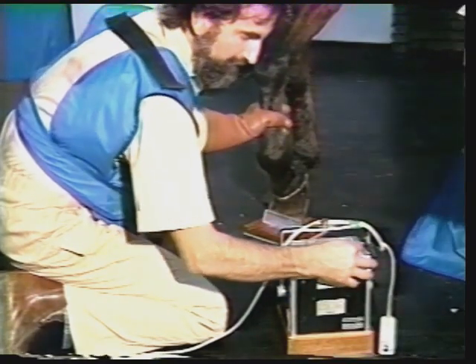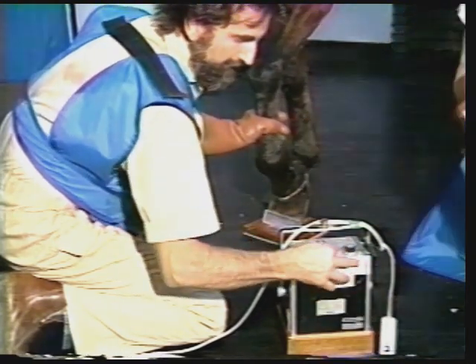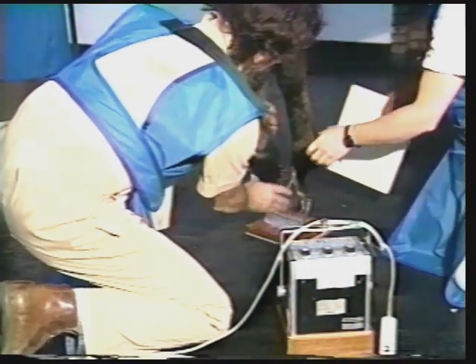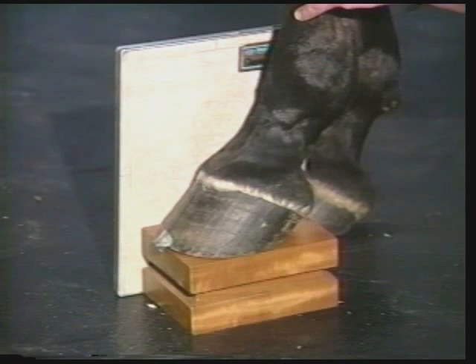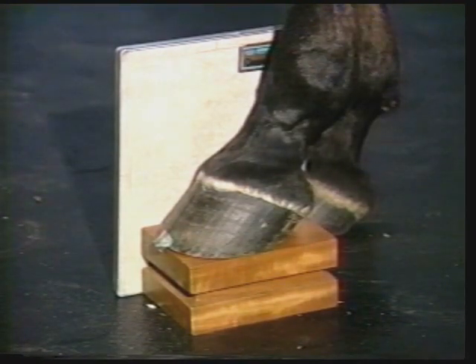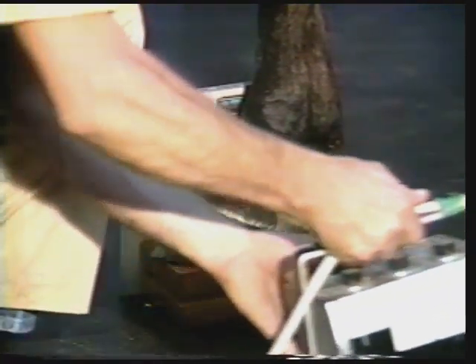It also allows me to set the foot in a position that allows me to take all my views, my standard views, as quickly as the operator can set the cassette into the device. Most horses accept this device very easily. It's such a quick, easy way to get around the horse. It allows me to put the handler in an area that is going to be out of direct line of radiation. My assistant does not have to hold the cassette, which removes him from the hazard of radiation.